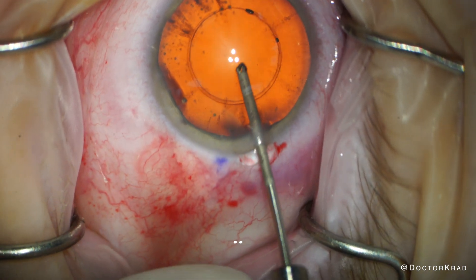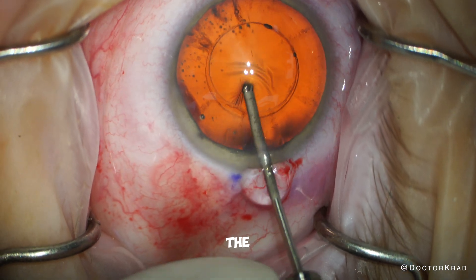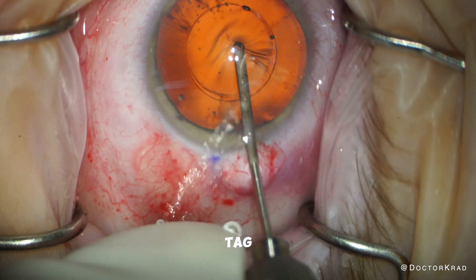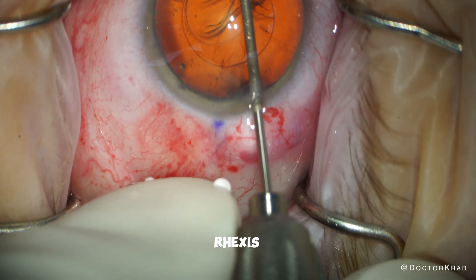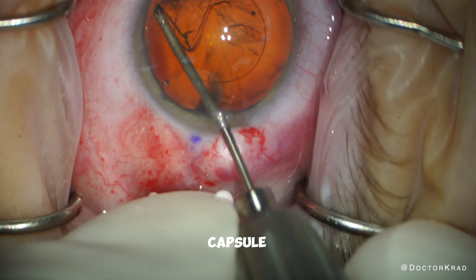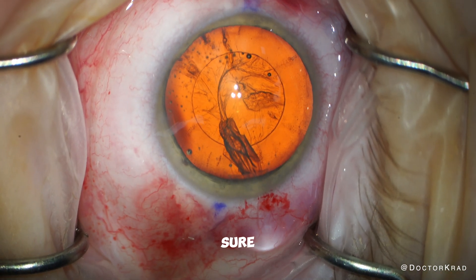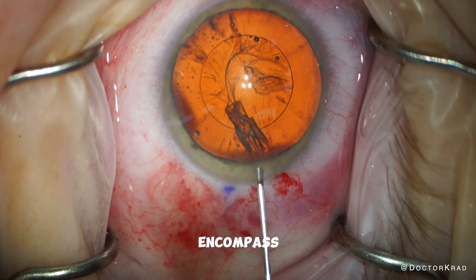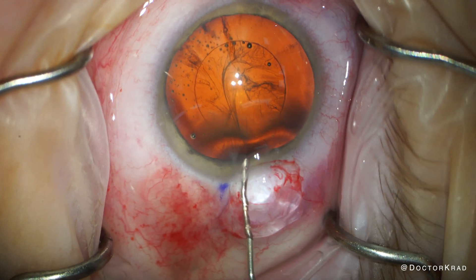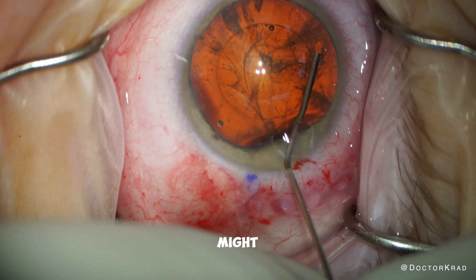Moving on. I am expecting tags in the capsulorhexis, and in the nasal area, there is a large tag. Tags are potential areas of vulnerability in the rhexis. You just grab the capsule and tear it manually, like you would a manual rhexis, but make sure you don't make it smaller than that original planned rhexis size, because you need to make sure you encompass the entire tag. Tear it in a manner that will be slightly peripheral to where you think any tags might be.